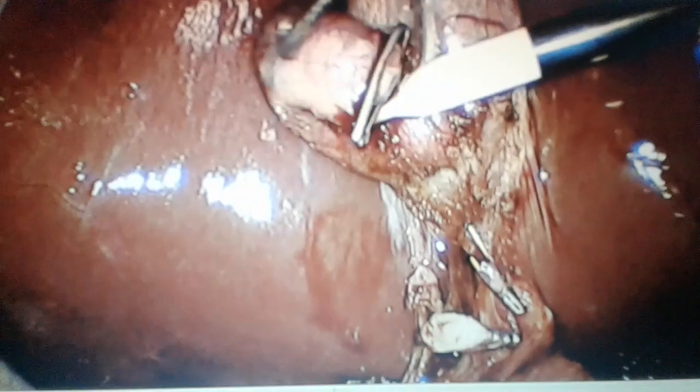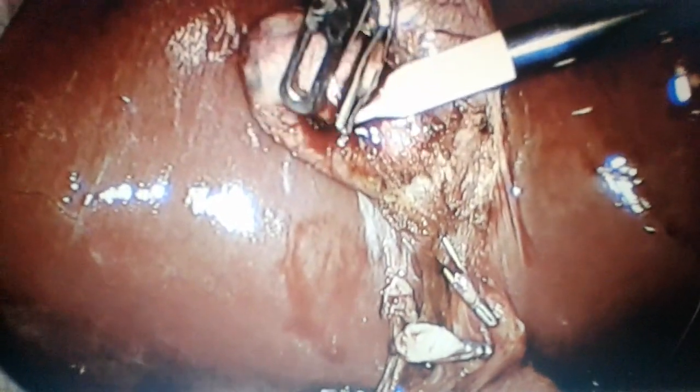Can you see? Yes, very good. Good observation. Don't panic, just hold the gallbladder site from where it has come and continue your dissection.